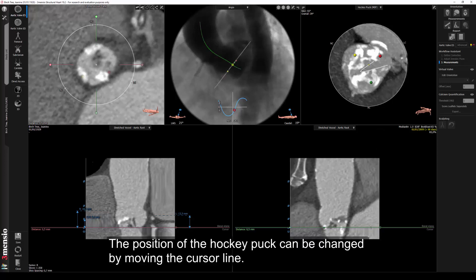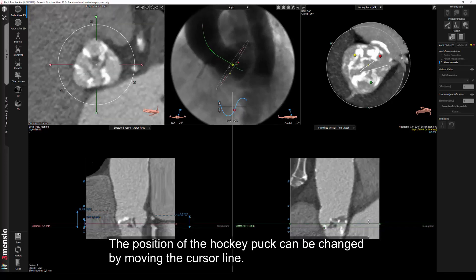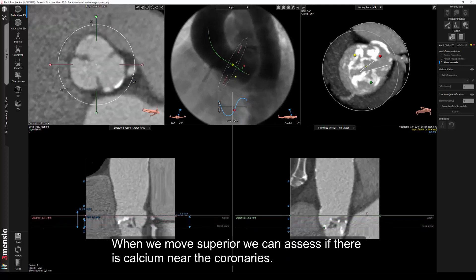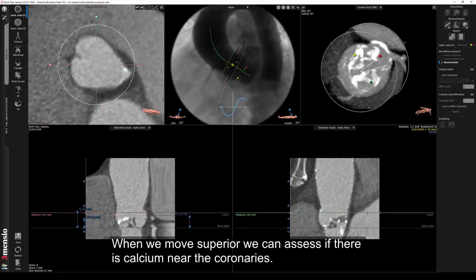The position of the hockey puck can be changed by moving the cursor line. When we move superior, we can assess if there is calcium near the coronaries.